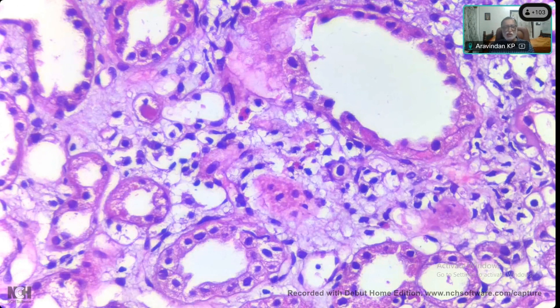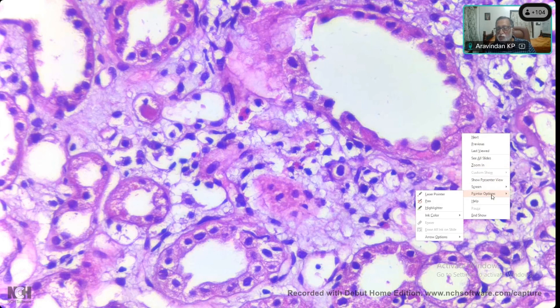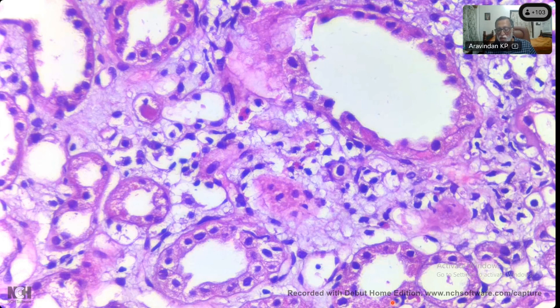A lot of lymphocytes in between the tubules, edematous stroma, edematous interstitium, and any other cell other than lymphocytes? Yes, I noted an eosinophil and a plasma cell. You can see quite a few eosinophils spread in between this. So with this, what would the conclusion be? And not only that, sometimes you see some lymphocytes infiltrating the tubules.